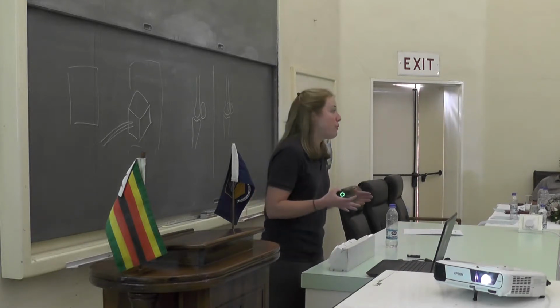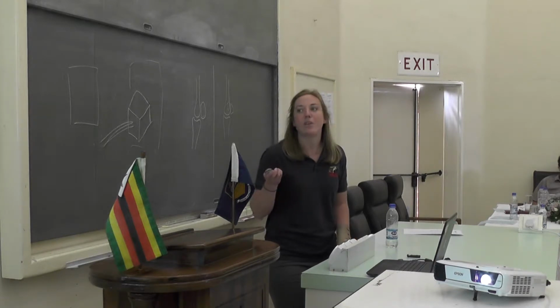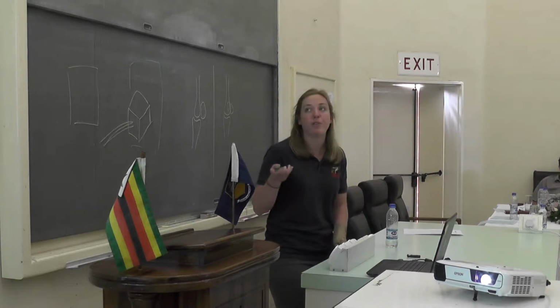So, moving on to actually positioning, there's all sorts of assistance that you can use for your positioning. You will need to use someone to hold the animal, but you can make your life easier as well. So if you want to use any of these blocks, for example, has anyone seen any of these to X-ray the foot of a horse? Exactly, so you can make a horse stand on them instead of having to hold the leg necessarily in a still position, because remember, you have to be as still as possible. So if you have something where the horse can put some weight on, that just makes your life easier.